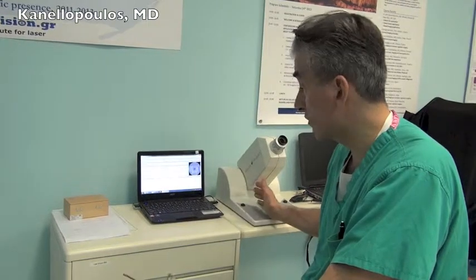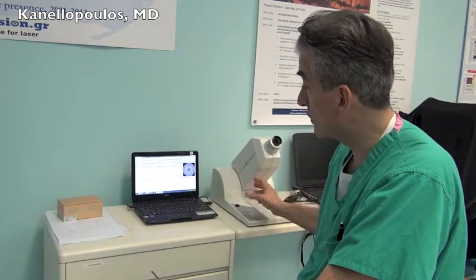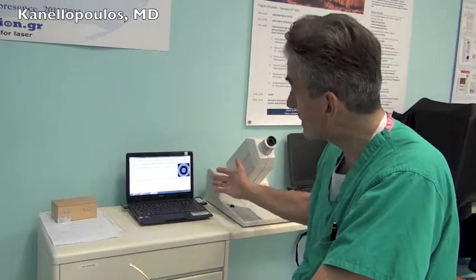We're going to go through more technical aspects, but it's a very simple test. It takes under 10 minutes to perform, and the actual raw data acquisition is about 2 minutes. It's very easy to train patients, even older patients.